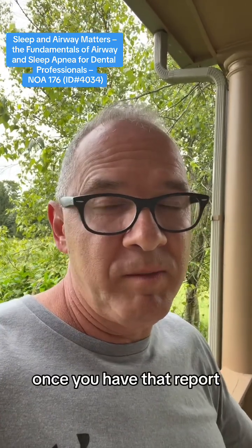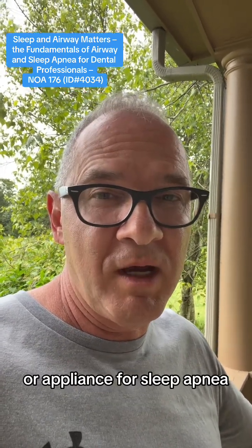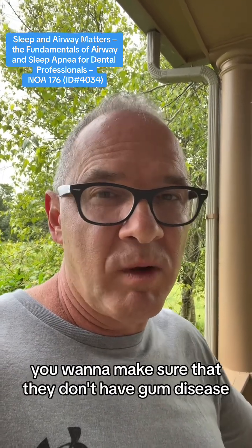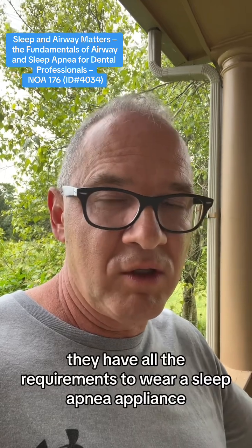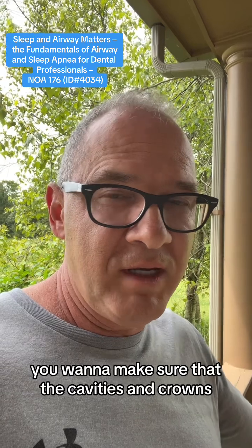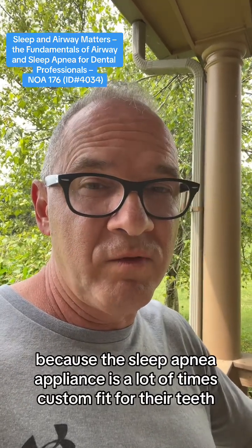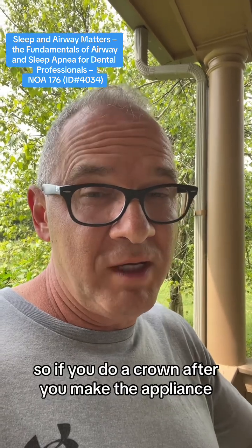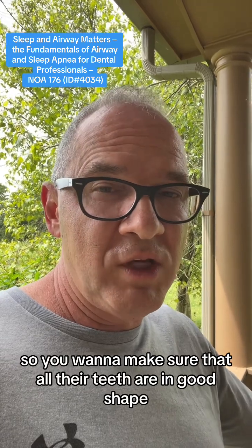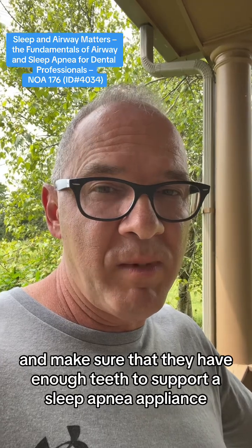Once you have that report, if the physician told you that you can make the patient this oral appliance for sleep apnea, then all you have to do is select the appliance that you're going to use. You're going to bring the patient in. You want to make sure that they don't have gum disease, that they have all the requirements to wear a sleep apnea appliance. For example, you want to make sure that cavities and crowns and things like that are taken care of, because these sleep apnea appliances are a lot of times custom fit for their teeth. So if you do a crown after you make the appliance, it may not fit afterwards. So you want to make sure that all their teeth are in good shape and there's no gum disease, and make sure that they have enough teeth to support a sleep apnea appliance.